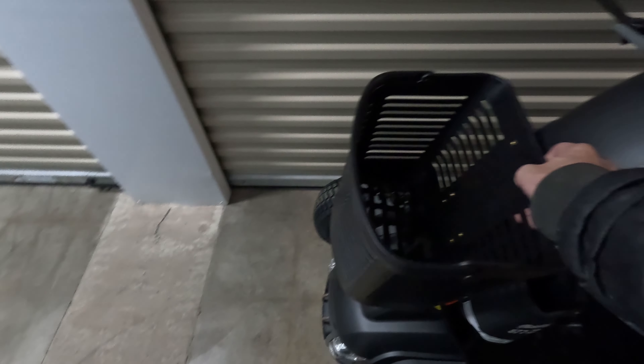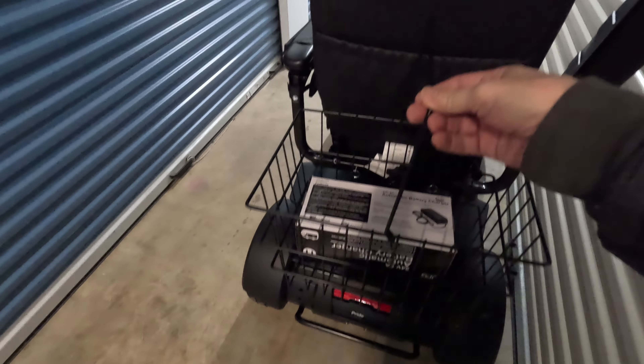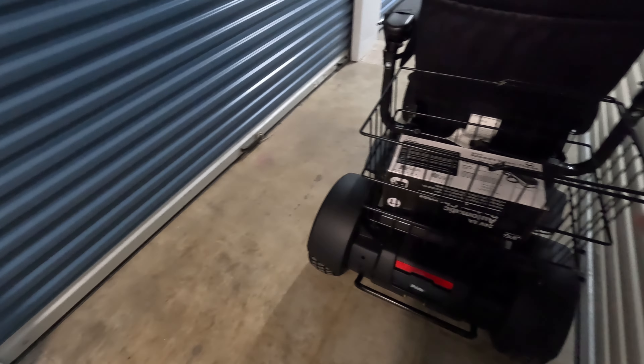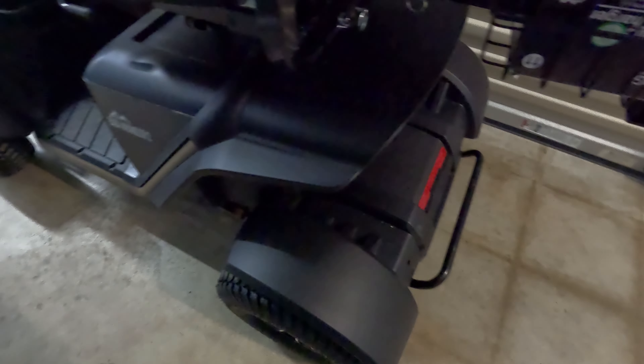This basket is removable — it's easy to remove, but a little more difficult to put back in. It doesn't quite line up. This rear basket oddly has a handle, but I don't think you'd really want to carry it because it might have a big piece sticking out here, which would be a little bit inconvenient.